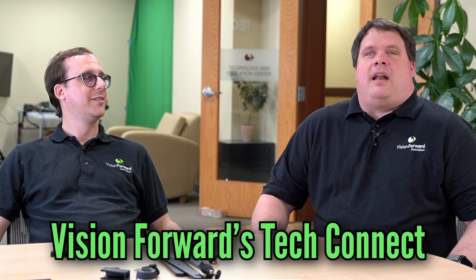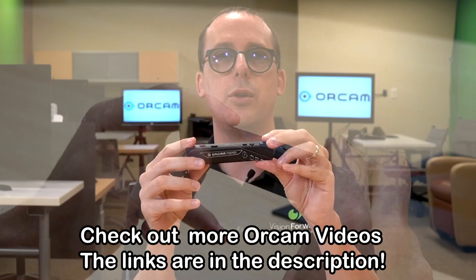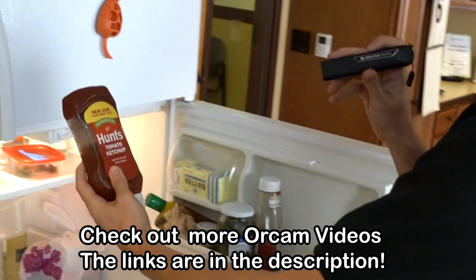Hi all, welcome back to another Tech Connect. Today we are taking a look at an exciting product from OrCam. They make some really cool OCR devices. We're looking at the OrCam Stand, which is specific to their OrCam Read and OrCam Learn device. If you're interested in what the OrCam Read and OrCam MyI Pro can do, take a look at some of our past videos where we break down button layout and get more specific on some of the tasks you can complete. I'm going to turn it over to Luke, and we're going to take a look at the stand specifically — he's got his toolbox out ready to put it together.